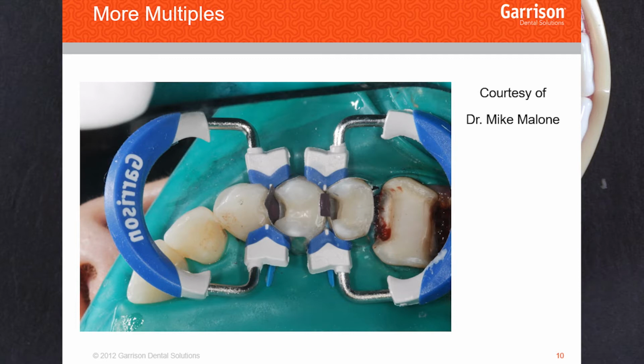So now he chose, in this case, he had enough room to be able to flip that one ring around, the distal ring facing the posterior of the mouth. That is a little bit tricky placement, and I'll show you that here in just a second because of the angle that the ring has on it itself. It's about a 105-degree angle. They don't come off at 90 degrees. The tines and the body of the ring are not 90 degrees. They're about 105. And that added angle in there can make that placement, that backwards placement, a little bit tricky.